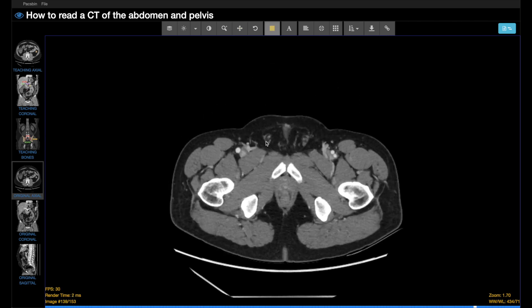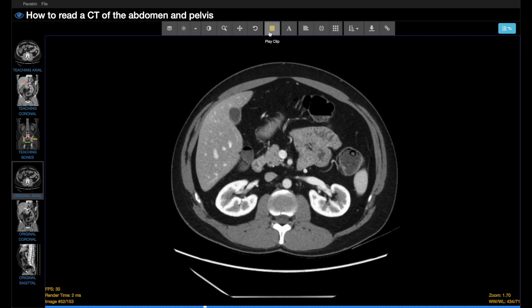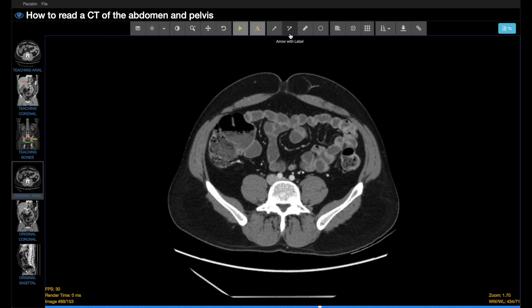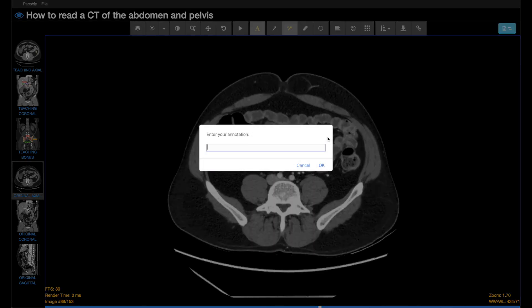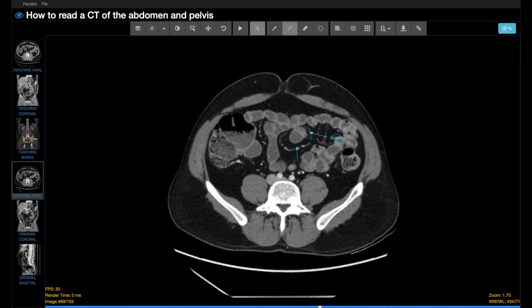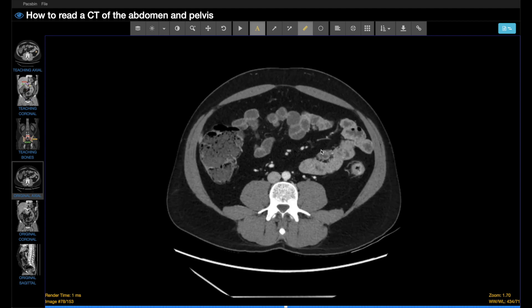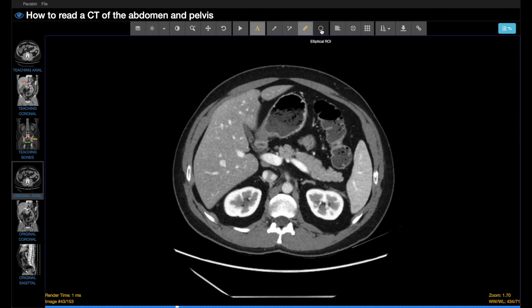You can play a cine, which is probably most useful in the setting of ultrasound, and there are basic annotation functions. You can draw arrows to indicate abnormalities, label structures, and measure key findings, which we generally do in two or three planes — AP with transverse, and then for an important finding we'll include a craniocaudal measurement as well, which we'll do on the coronal or sagittal view.